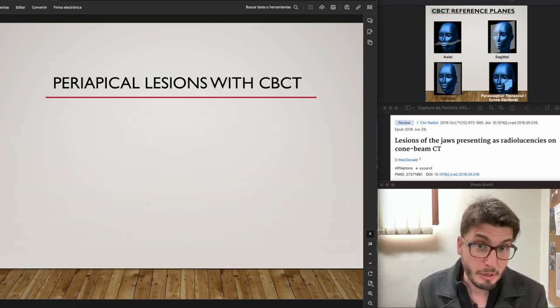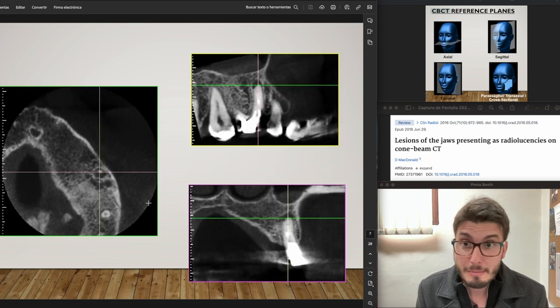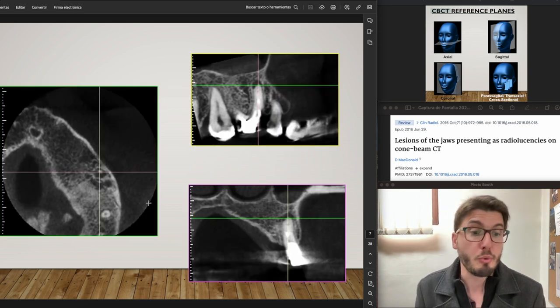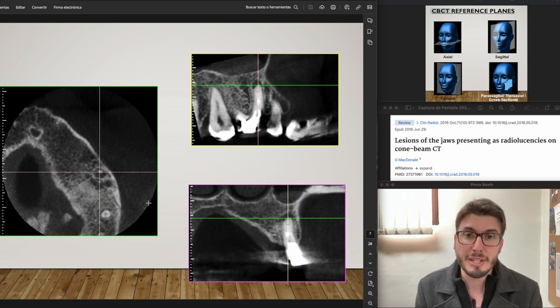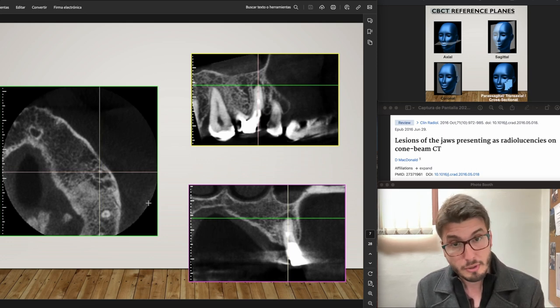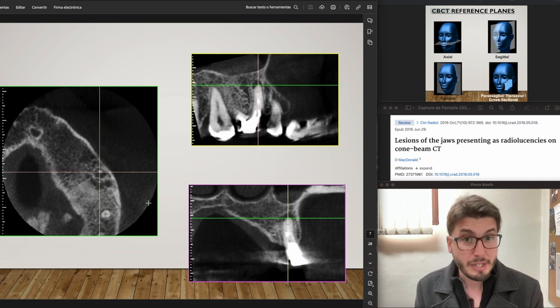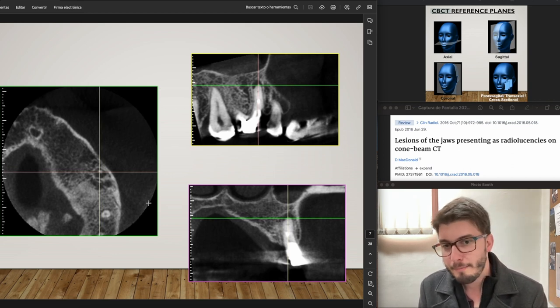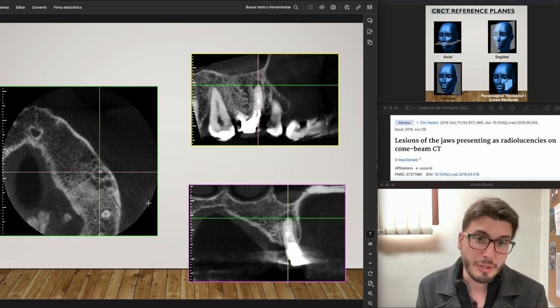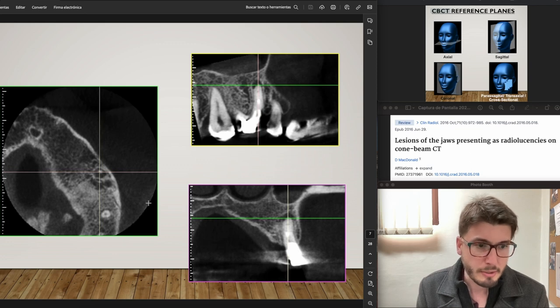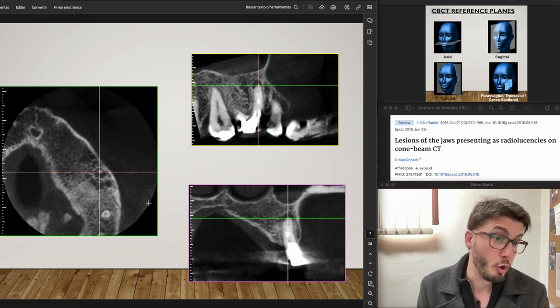Now let's talk about periapical lesions with CBCT. We are seeing a periapical lesion — hypodense, well-limited, homogeneous, small, symmetric. It's very small, so the first option of the radiographic diagnosis would be a periapical granuloma.